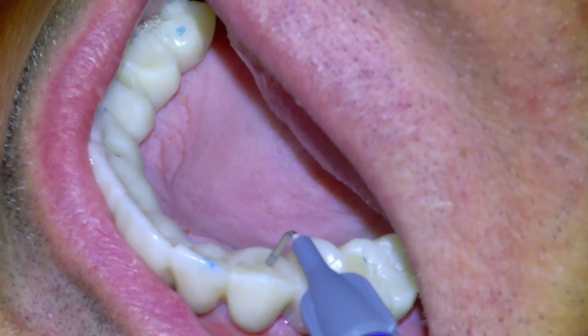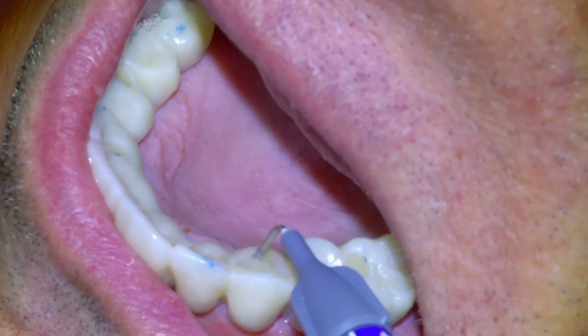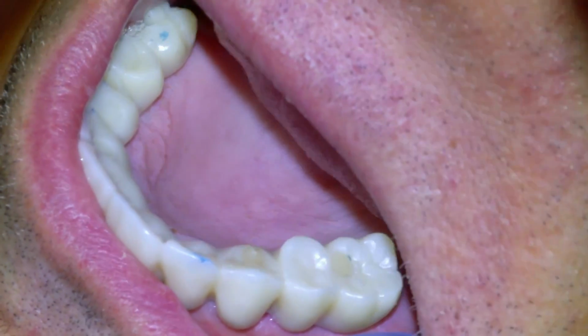So I'm going to fill up the screw holes, and then Jackie's going to cure the composite there.